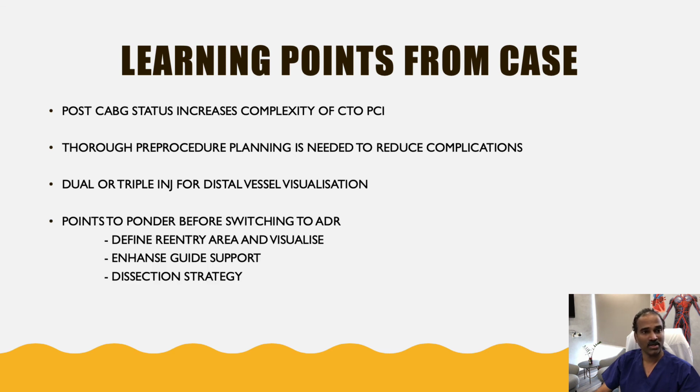Points to ponder before switching to ADR are: define the reentry area and visualize it, enhance your guide catheter support, and also decide on your dissection strategy, where to start and where to end.